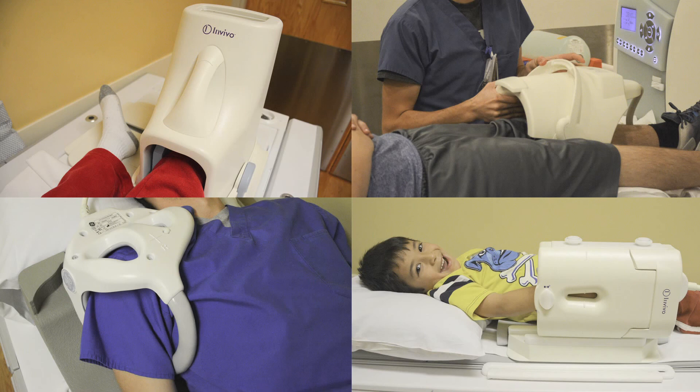Special listening devices, known as MRI coils, are necessary as well as powerful computers to create the detailed joint images that the doctor will read in order to help determine how best to treat your child. Every MRI scanner has multiple coils that are used to image different joints.